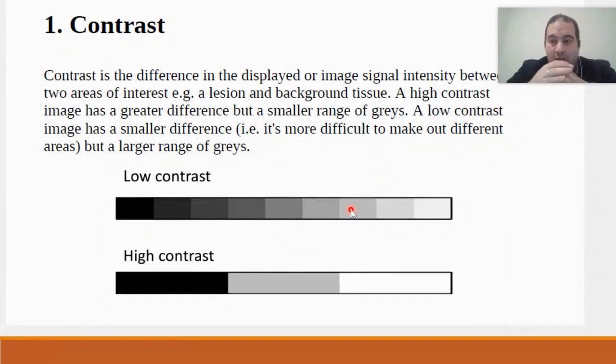For instance, now you have a focal lesion present in an area like the liver. This focal lesion has a strong difference. So for example, if you did something like giving a high kV, your work now involves parameters that you want to make visible or clear. In the process of clarity or selecting the parameters that make this clear, you need to first see what you want to observe in the image. This means choosing the parameters that give you the optimal contrast. Here, I can't say that high contrast is better or low contrast is better. It depends on the situation.